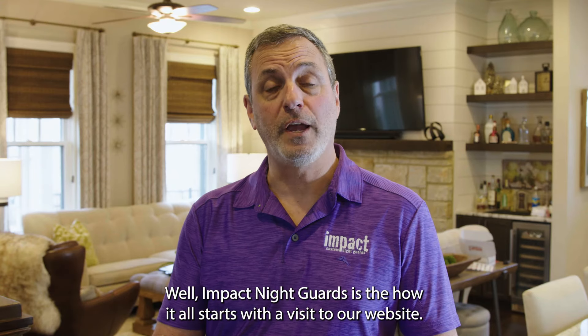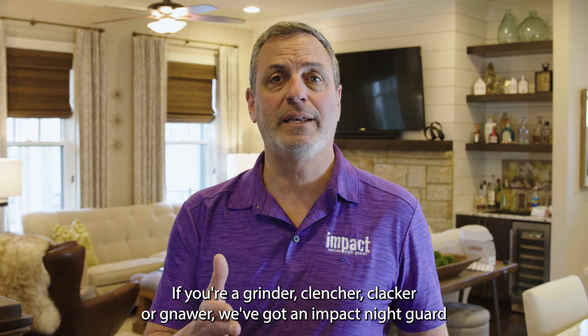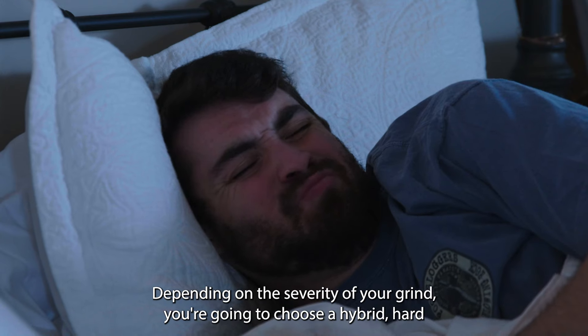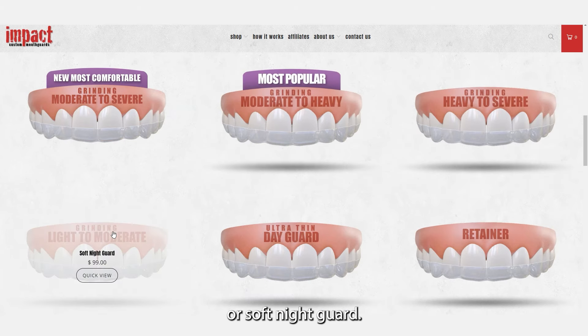It all starts with a visit to our website. If you're a grinder, clencher, clacker, or gnawer, we've got an Impact Night Guard that'll fit you perfectly. Depending on the severity of your grind, you're going to choose a hybrid, hard, or soft night guard.